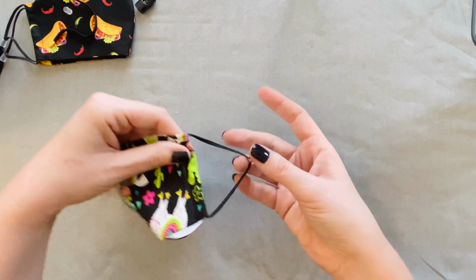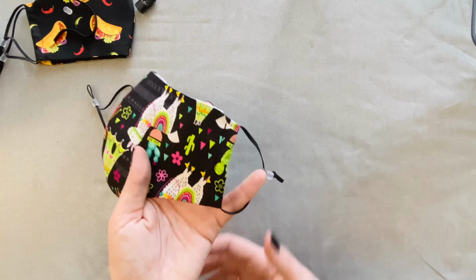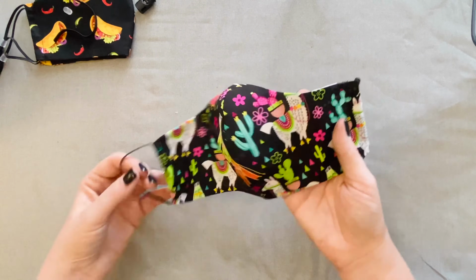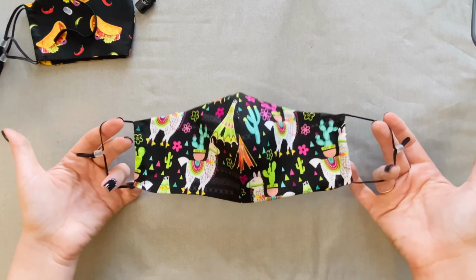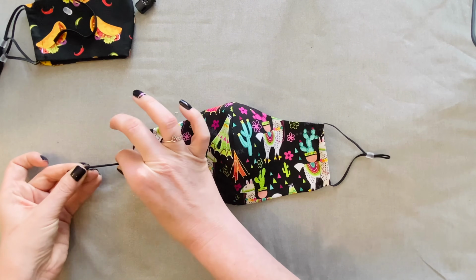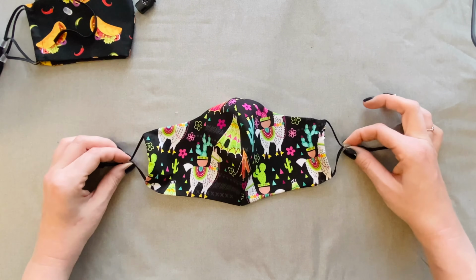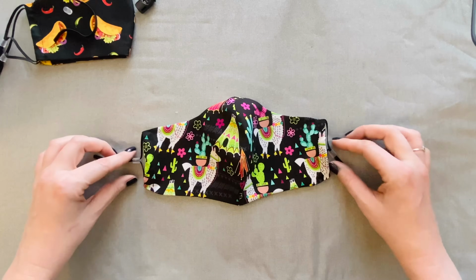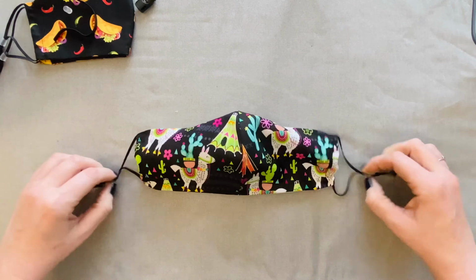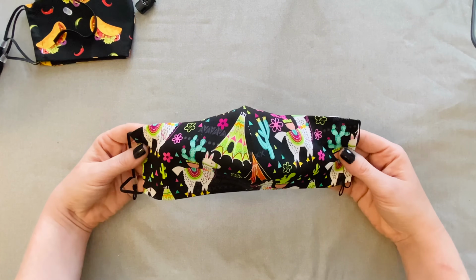For whatever reason, I did this as a 10-inch loop. If 10 inches isn't enough, cut more, but I did 10, I think that's plenty. And this mask is all ready to go. So once it goes on to my nephew, we can adjust this very easily. It's not heavy, they're nice and soft, it's thin elastic, so it'll be nice and comfortable for him. And that's basically it. That's how I've been making sure I can make my child masks adjustable.